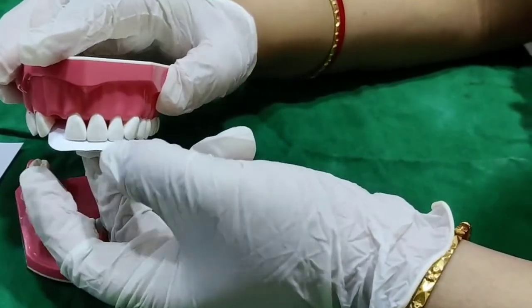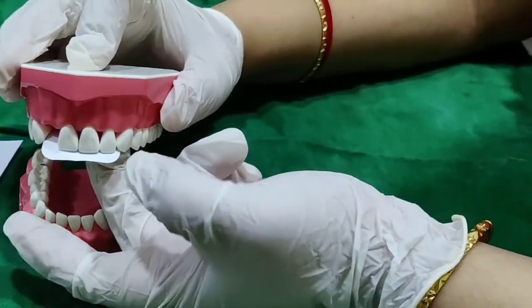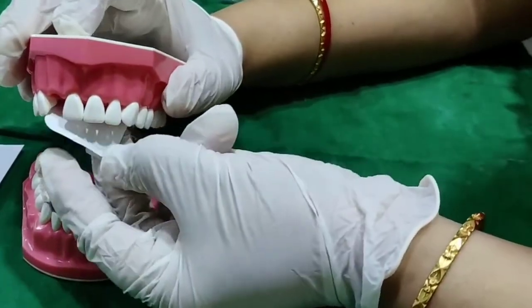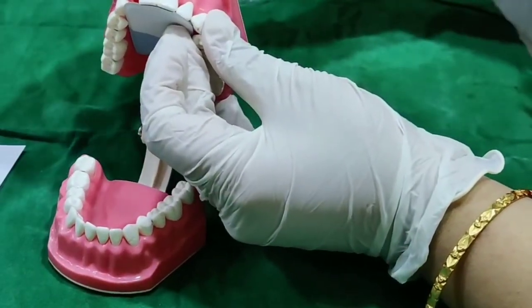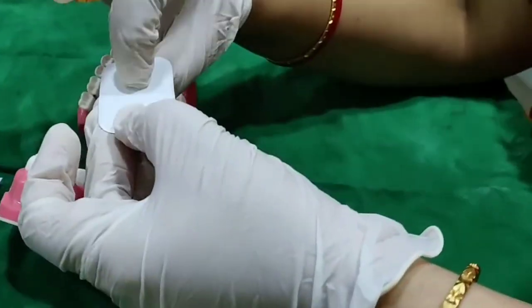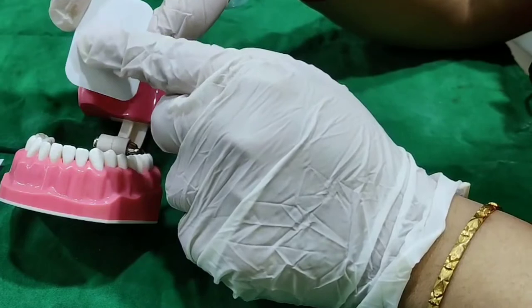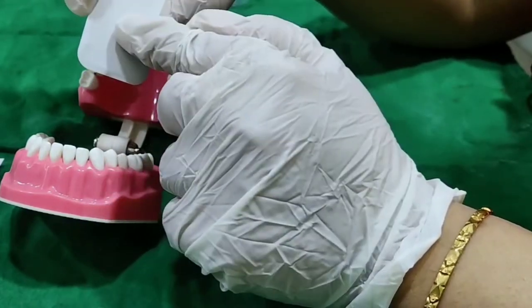For a diagnostic X-ray, the film border should be 2 mm below the incisal edge — this is the ideal position because we are concerned about both crown and root together. For an endodontic X-ray where you want to see the apex, push the film inside until it is equal to or past the incisal edge. The apex should come to the center of the film. In endodontics, we want to see the working length, so the root should be at the center of the film.